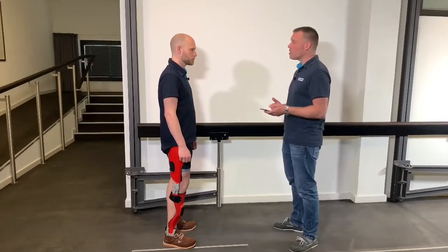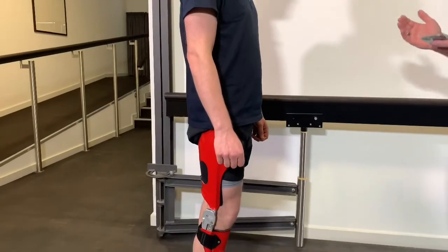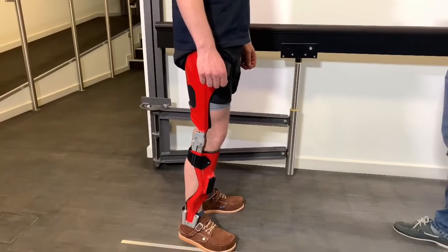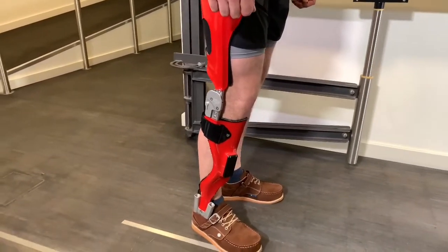Before you take the first steps, I would like to turn on a beep tone. This beep will sound whenever the controller has recognized a step or a swing phase and will enable the unlocking of the joint. This beep can have either this sound or this one. Why are there two different tones? For the cases when we install the Neurotronic system on both sides — when the user has a Neurotronic knee joint on both the left and right legs — it makes sense to be able to differentiate the beep of the left leg from the beep of the right leg.